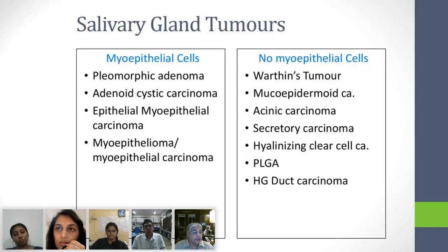That's very important. And I like to think of salivary gland tumors in this way: the salivary gland tumors that have myoepithelial cells and those that do not. And this is a short list because we don't see more than these kinds of tumors usually. Okay? So the epitome of a myoepithelial cell containing tumor is a pleomorphic adenoma, because you see all types of myoepithelial cell morphology as well as stroma.